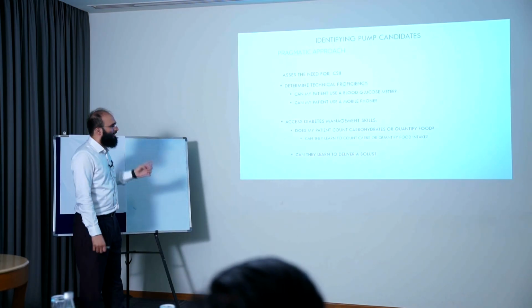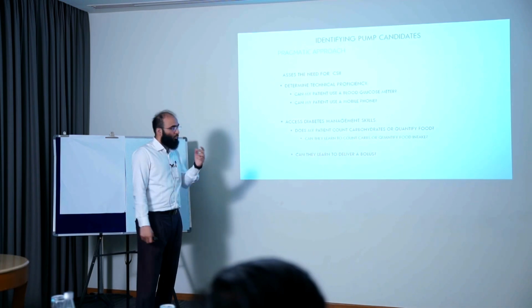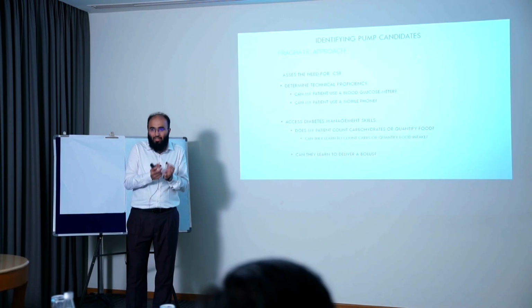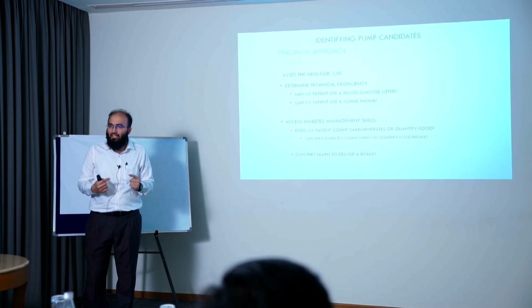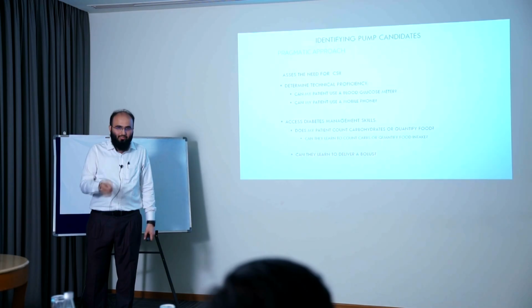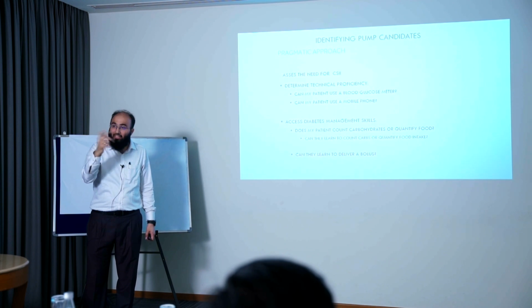Diabetes management skills. Does my patient count carbohydrates or quantify food? Can they learn to count carbs or quantify food intake? He might not know how to count carbs. If you teach him, will he be able to count carbs and input it in the pump? And can they learn to deliver a bolus? For you and I, we are healthcare professionals, it is quite easy. I told you, press the bottom button and then you have to enter. You can do it. You might fail the first time, second time you will manage. Will the patient be able to do it? Blood glucose has to be entered in the pump. Will he be able to do it?